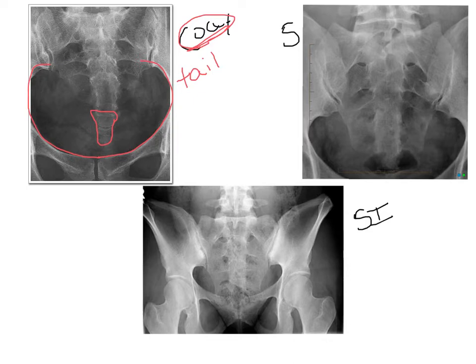Okay, so because we've angled the tube, the type of distortion we are seeing is shape distortion. What we have actually done is foreshortened the sacrum so that we project this coccyx into the pelvic brim. We also make the brim appear elongated. The brim is important to evaluate because this is going to be how we look at rotation. Is the coccyx equidistant from its borders to the lateral margins of the pelvic brim?